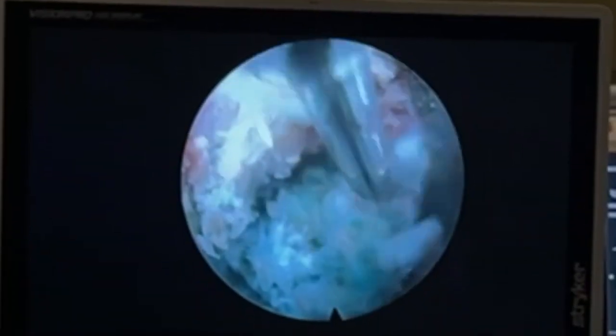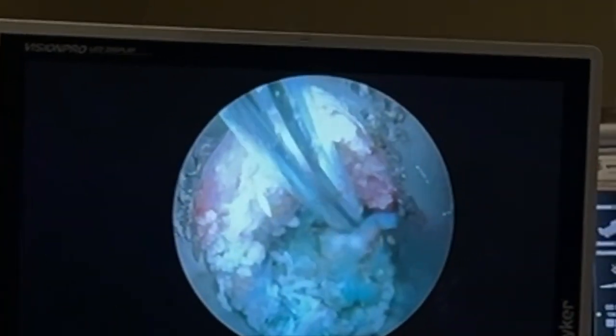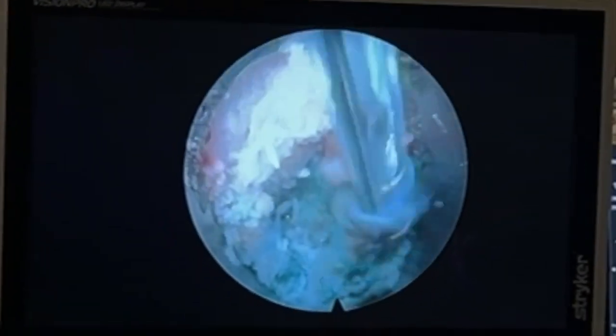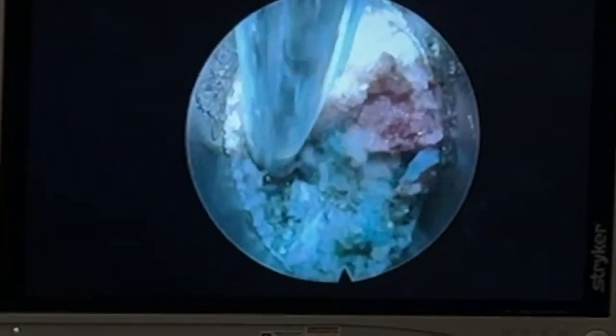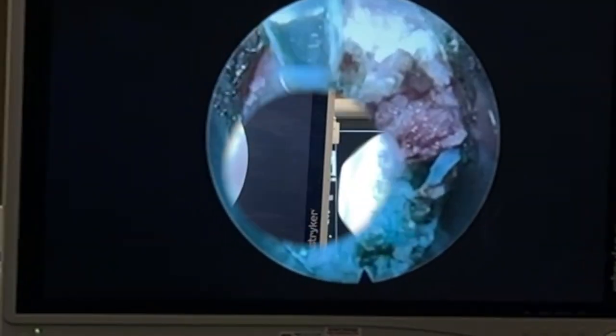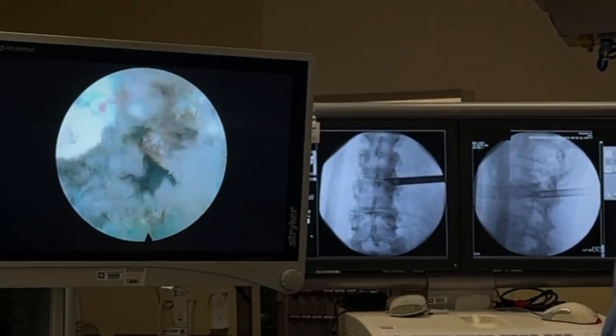I'm just gonna keep on cleaning this up until we can see the dural tube pulsating and I can pass all my instruments back and forth and any trapped blue pieces of disc is removed. That combined with restarting the healing process so it goes down the correct path instead of getting stuck in the chronic inflammatory path is essentially what the treatment entails. That's the pathophysiologic mechanism of treatment. Okay, so there's the edge of the bone spur.